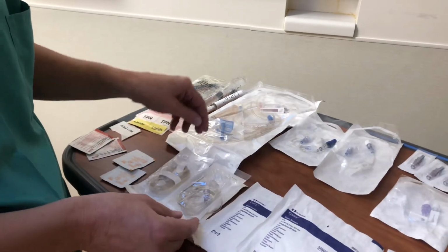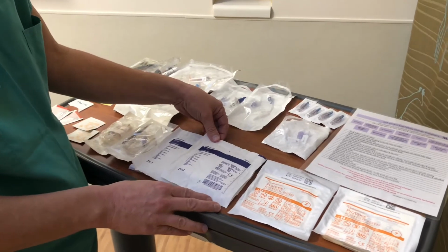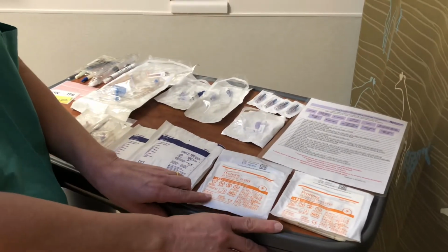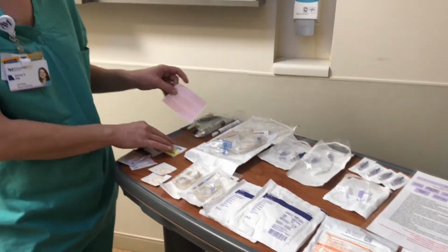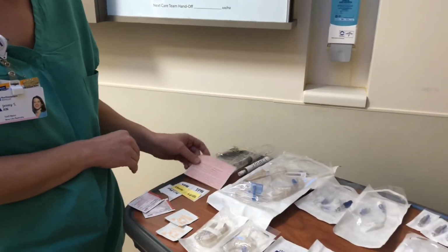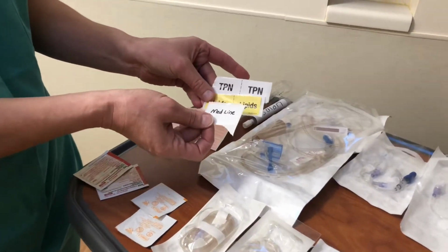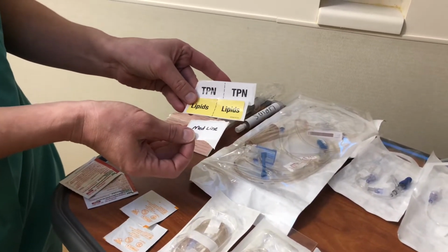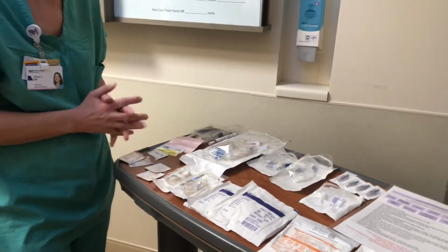And this is the tubing we will use for our lipids and also for our medication line that we leave in place. Then we're going to have 2 packs of sterile 4x4s. And then 2 pairs of sterile gloves. You can also at this time get your IV change labels, and then also your fluid identification labels that we talked about in part 1. And you can have all of those ready for after you prime your fluids.